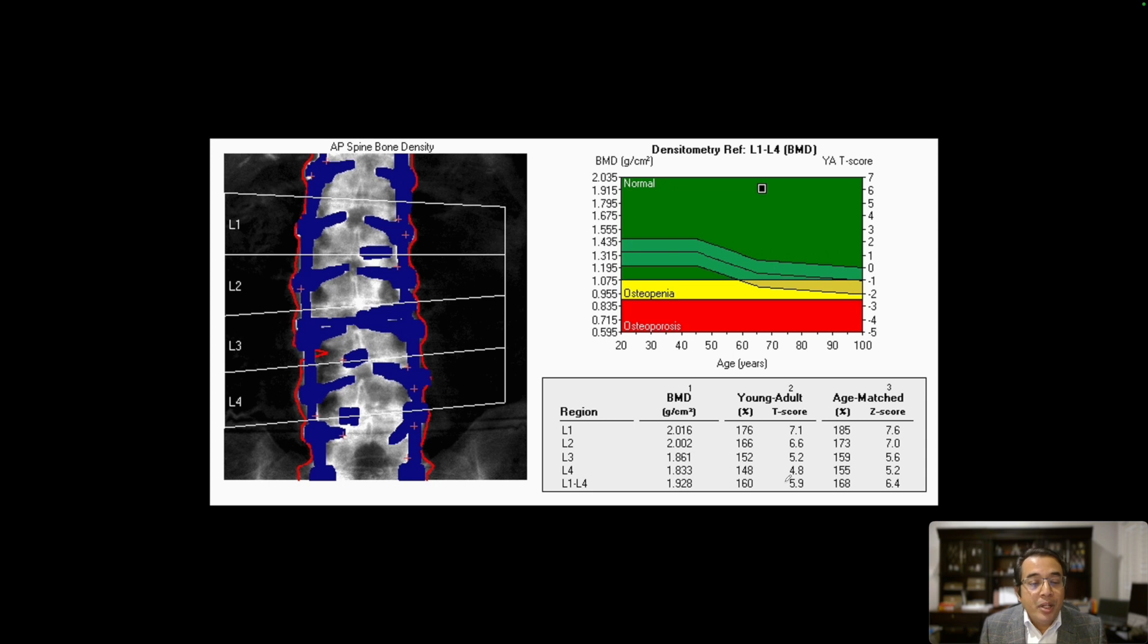Here is our last patient, and they underwent a DEXA scan. On the image of the spine, we see that they have extensive lumbar spine hardware, and the technologist has tried to draw the region of interest and process the study.